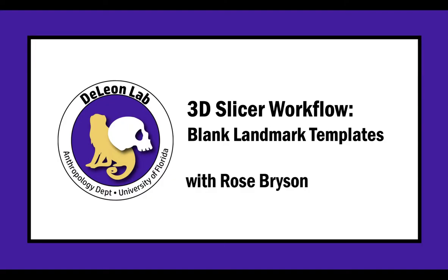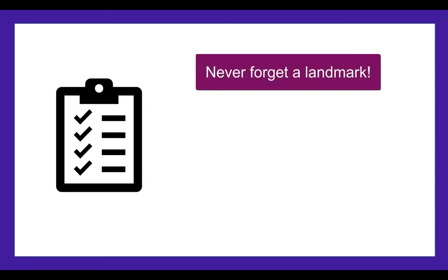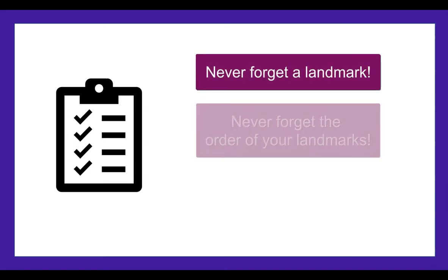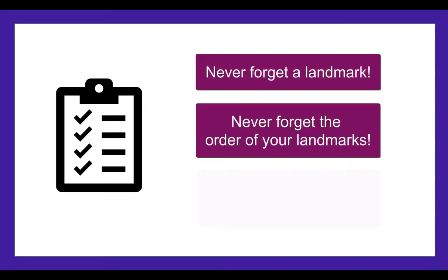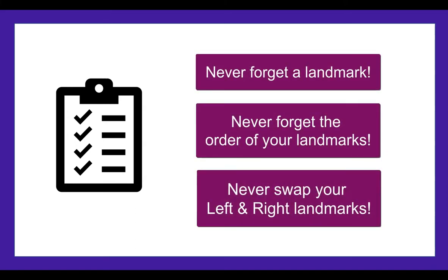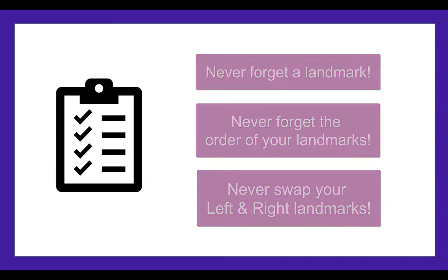Hi, my name is Rose, and today we're going to cover how to make a blank landmark template in 3D Slicer. This is a really useful tool that can help save you time and help with your organization. When you start with a ready-made template of your landmarks, you never forget a landmark, you never forget their order, and you don't accidentally swap your left and right landmarks. The process is pretty quick and simple, so let's dive in.